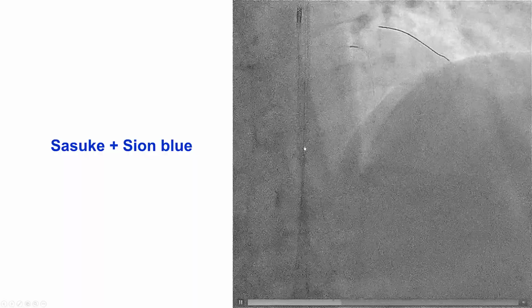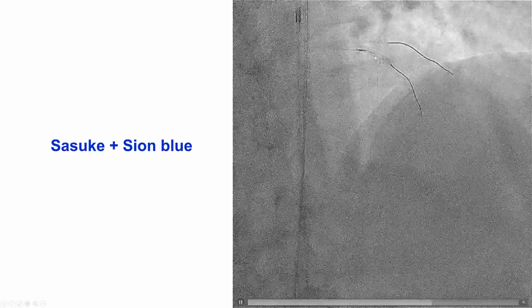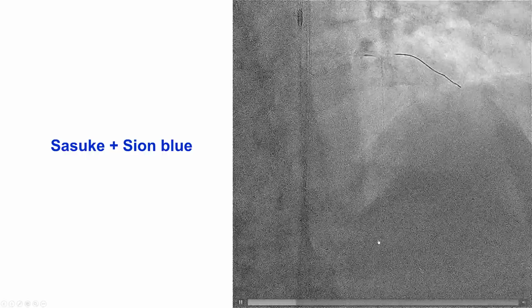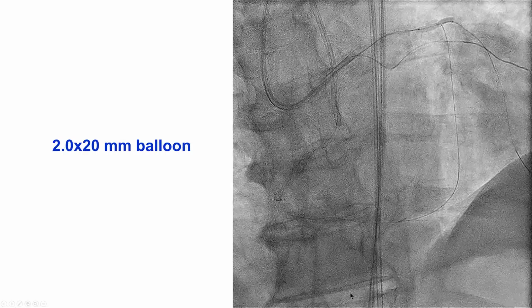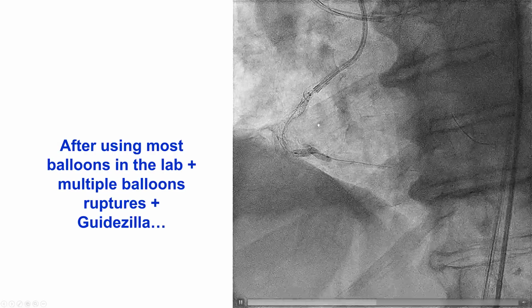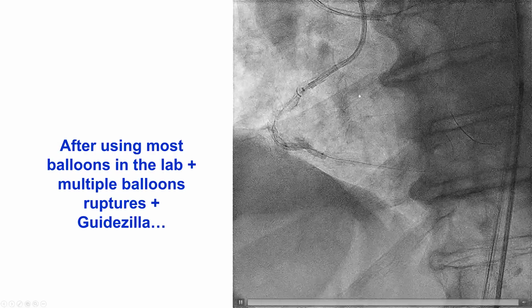We then thought that we would try to get an antegrade wire, so we used the dual lumen microcatheter to advance a guide wire into the LAD. And we thought we would remove the retrograde gear. That did not seem to help us actually with delivering equipment in the right coronary artery and stents. We ballooned the LAD, but we were unable to actually remove the retrograde guide wire.